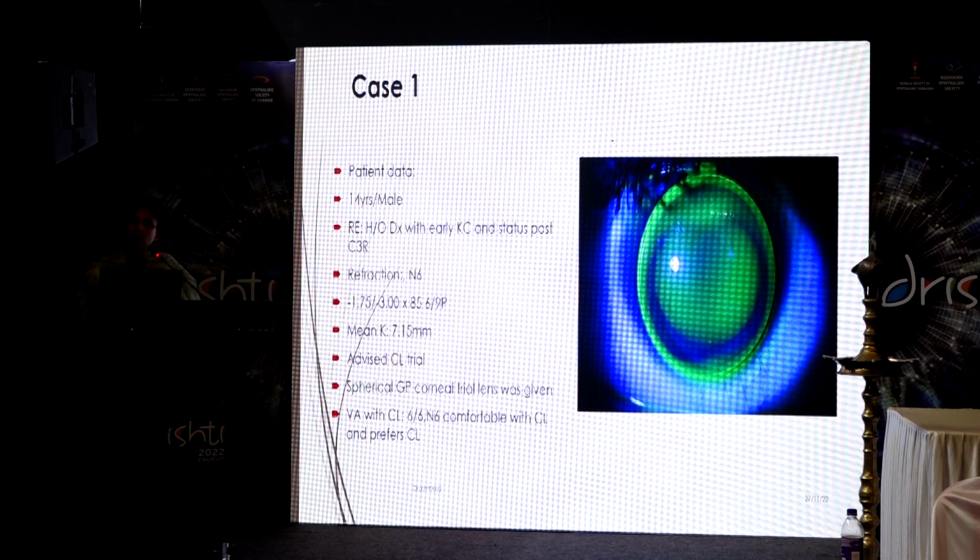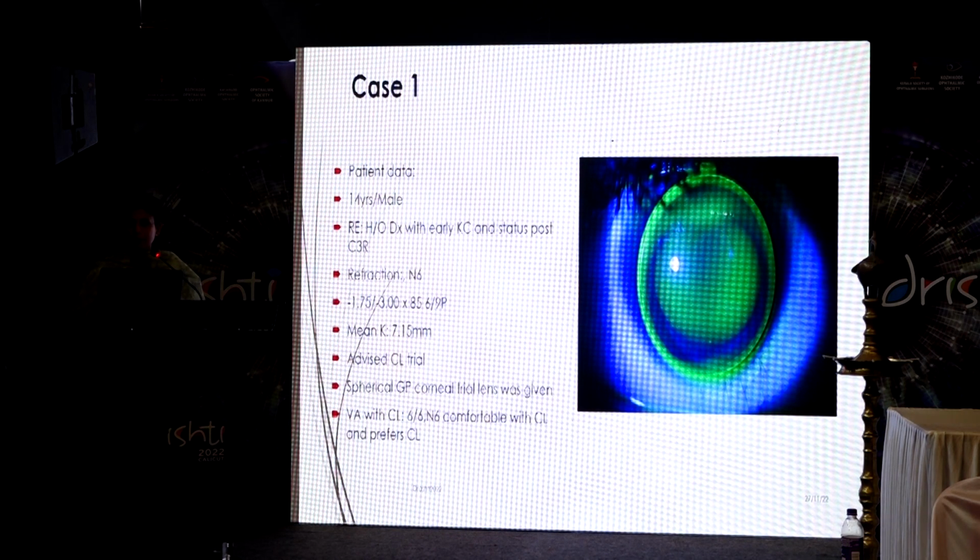What I see is that very many designs have entered the market recently, especially with scleral lenses. So as practitioners, everybody jumps into fitting the scleral lens first. As a practitioner, you need to be very mindful. Scleral lens should be the last design that you ever choose. You should always start with a corneal rigid gas permeable lens and see if it's working for the patient. If this doesn't work, I move on to my corneoscleral lens design. If that doesn't work, then I move on to the scleral lens.